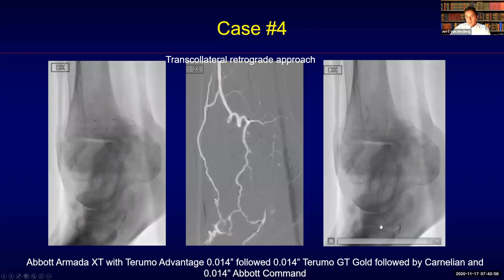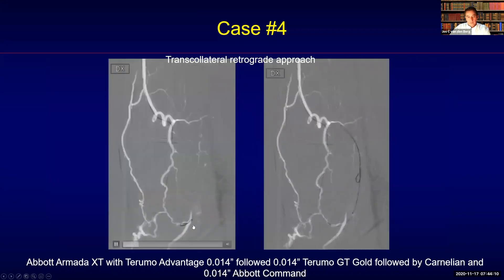At this point it is important to go back up again with your guide wire. In this case I used an Abbott Command in order to move a little bit more distally. Here you can see the guide wire now in place, going a little bit more towards the proximal segment of the plantar artery, and then the balloon catheter was advanced but got stuck again at this point.